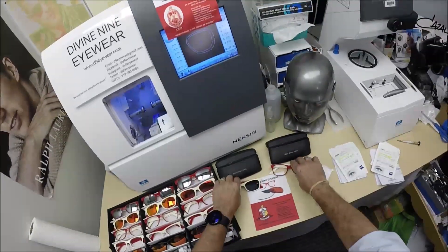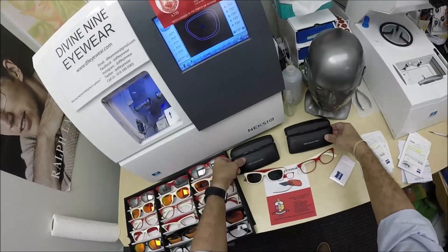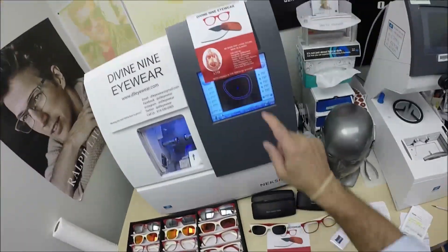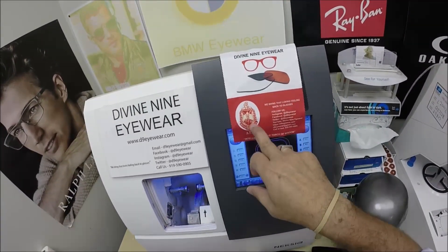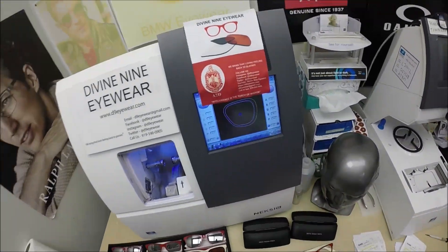Today I'm showing you Cheryl's two pairs of Delta Sigma Theta eyewear. Of course, they all come with the Delta case and the Delta cleaning cloth — one is here, the other's on the table, you get one with every pair. It's got all the social media on there, the Delta logo, the crest, and 'Intelligence is the Torch of Wisdom.'